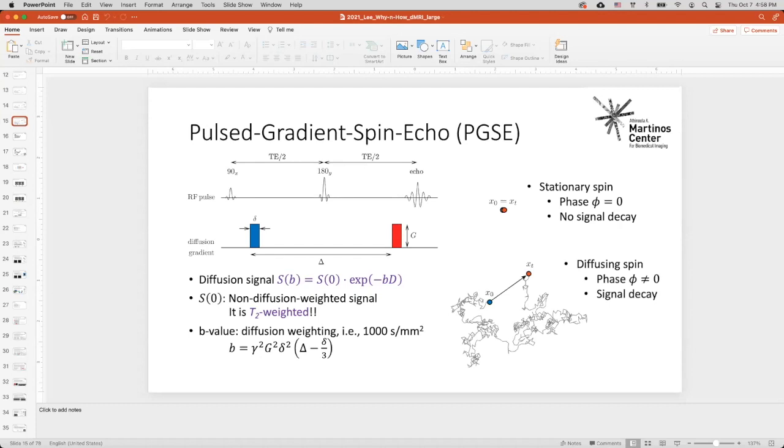So for example, for the resolution, there are several ways to increase high resolution image. For example, we can use G-slider. So in G-slider, we basically have a very special slice excitation. And we use different combinations of slice excitation to increase the resolution across the slice, but still maintain the SNR, because we still acquire a slab image.